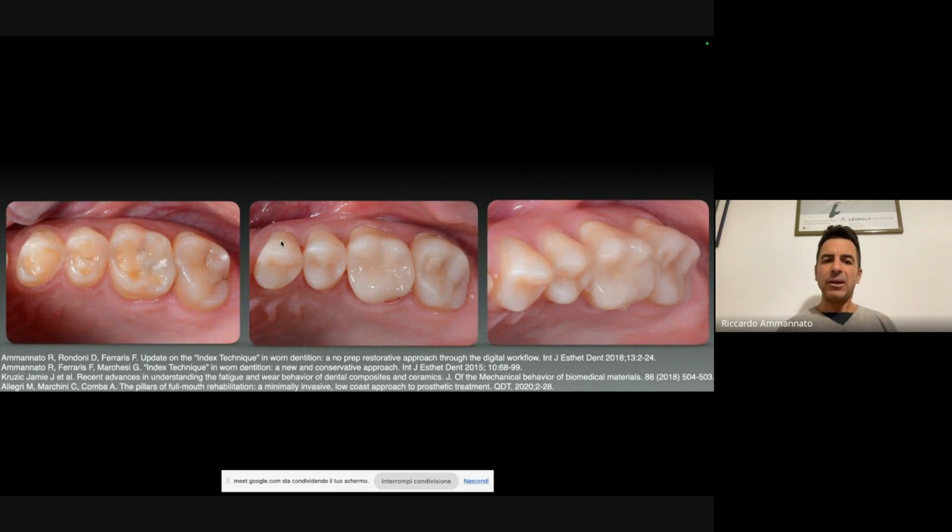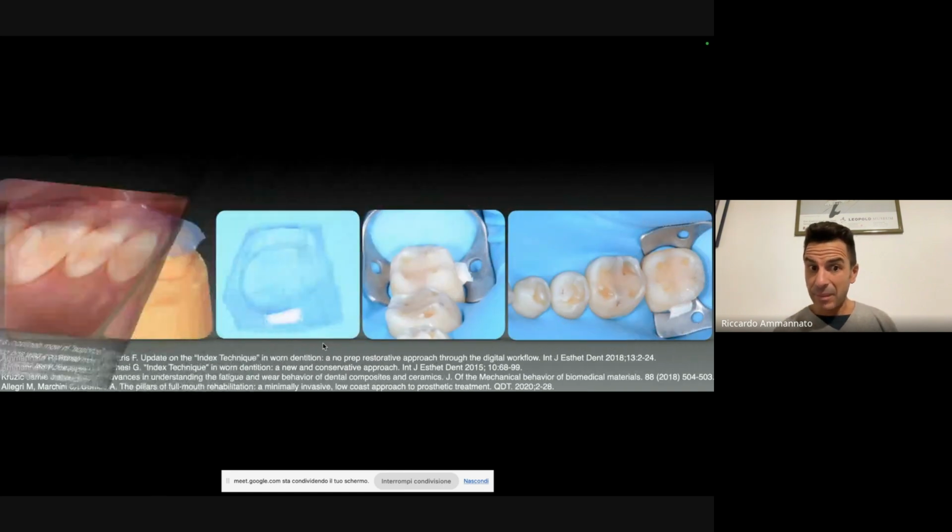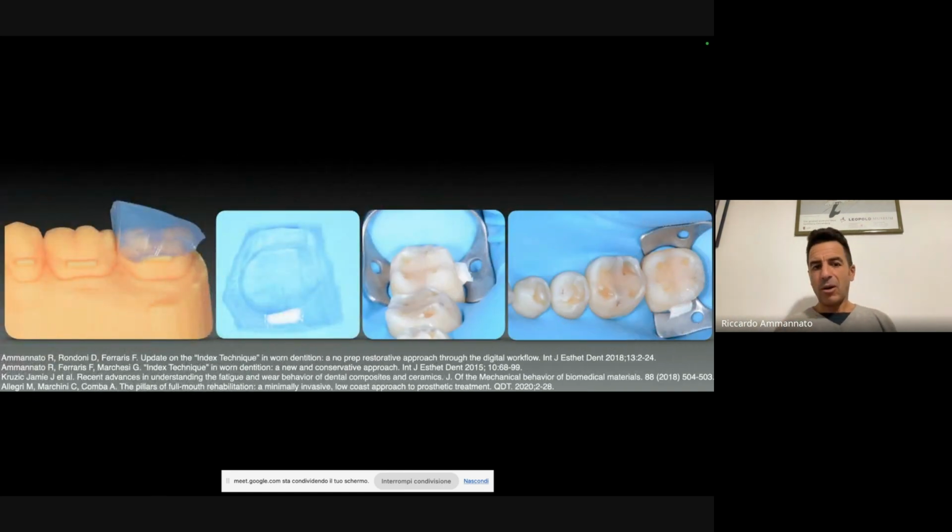So again here, one premolar, second premolar, second molar, molding approach, while here, this is one of the table legs with the glass ceramic overlay, onlay, okay?